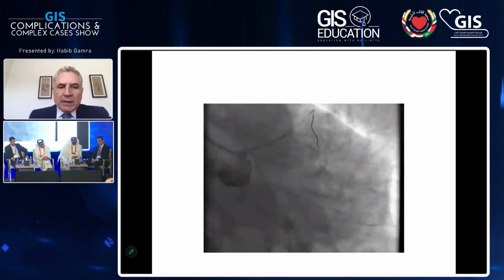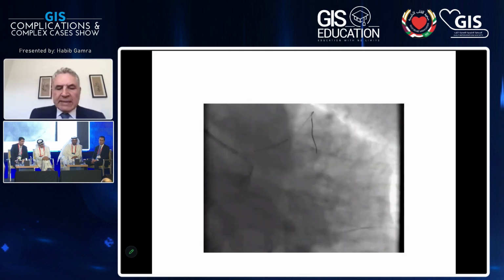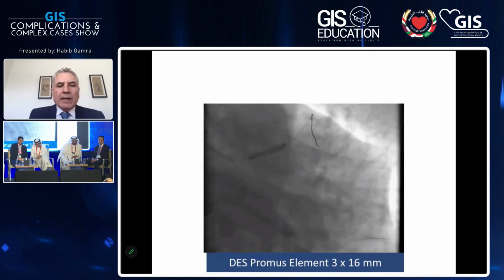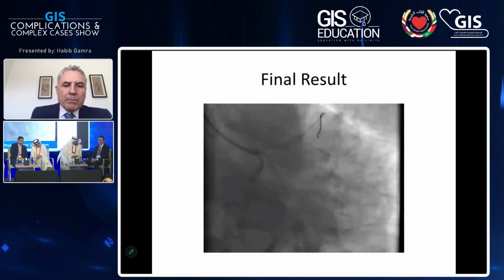So the colleague proceeded with the wiring of the lesion and direct stenting of that lesion, and a drug-eluting stent was placed.